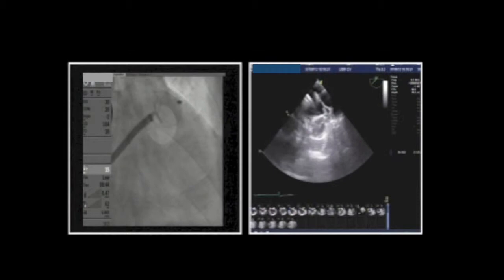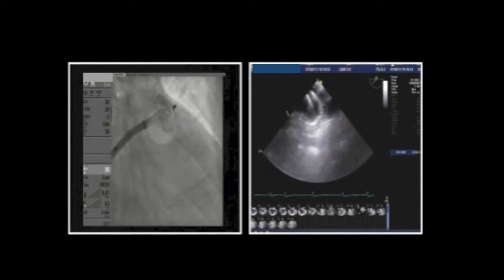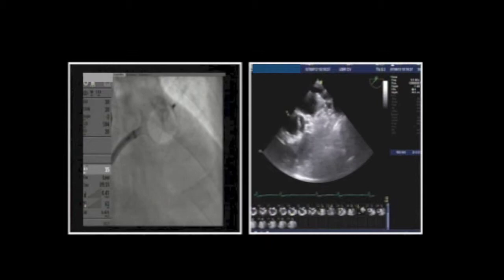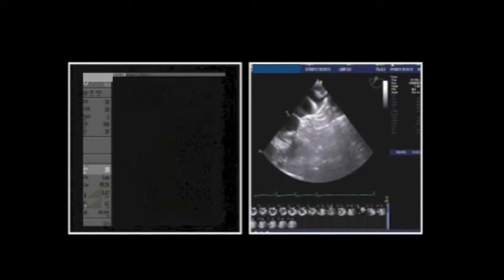We deploy the disc now by pulling back on the sheath. We release the counterclockwise tension previously applied to the system, then gradually open the disc. We form it in a diamond shape to create a pushing force — this is also a stability test. Then we gradually push the device in. The result looks not bad, but we could potentially cover the ostium better.